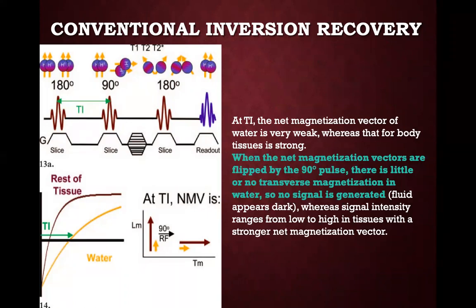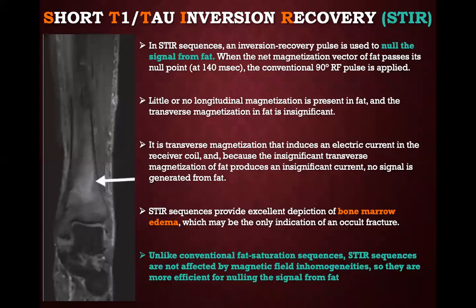Now, there are various types of inversion recovery. Please remember this. There are examiners who even ask this. First, if you invert only one tissue, this is called STIR. Remember, one tissue, STIR. You just invert T1 from fat, like a fat sat sequence.